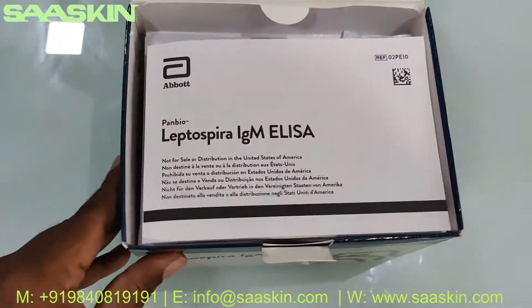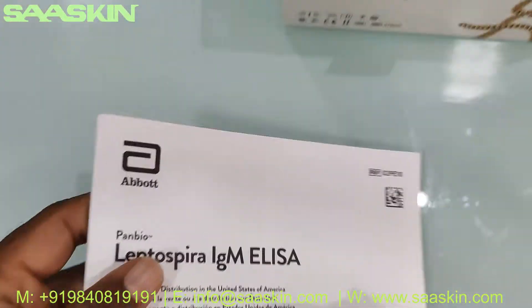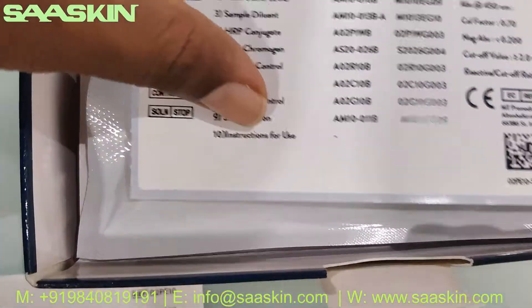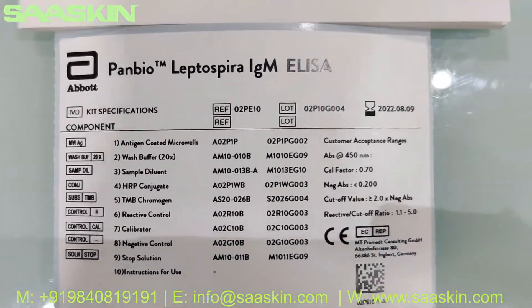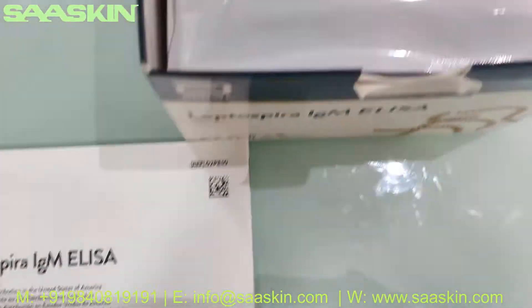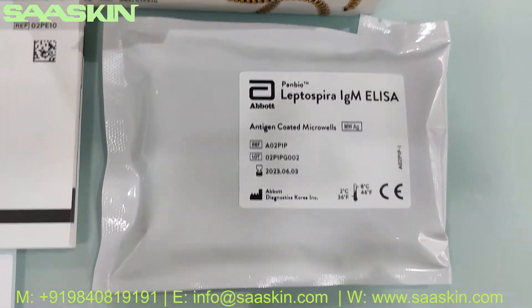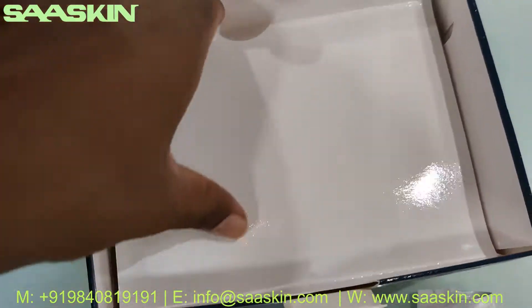Let me open this box for you. Here we go — inside you have the instruction manual, a complete booklet for use. There is also a sticker which contains all the component details. And you've got the antigen-coated microwells, which is the 96-well plate — here it is.